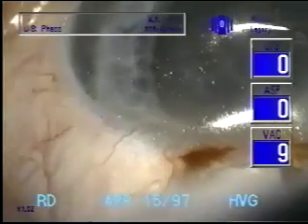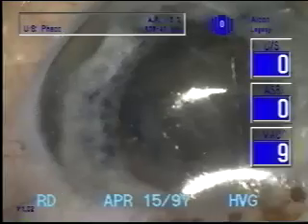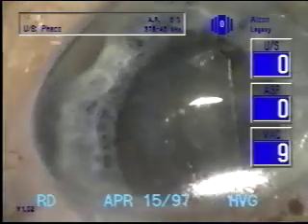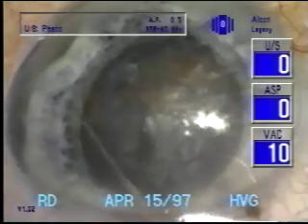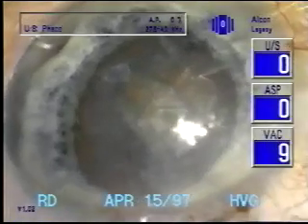The last case is another traumatic cataract, in this case with an iridodialysis that allows us to visualize the endocapsular tension ring and the lens loop at the edge of the capsule through the iridodialysis. Again, this loop was placed before the cataract was removed, and it was placed with a lens positioning hook.